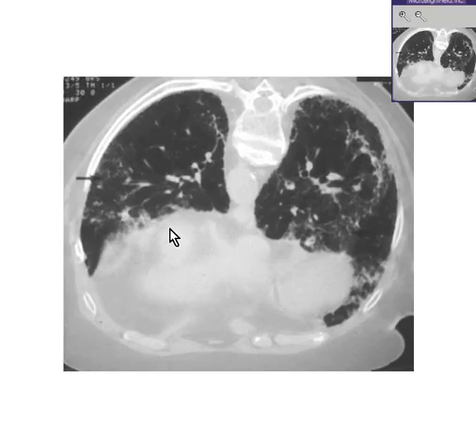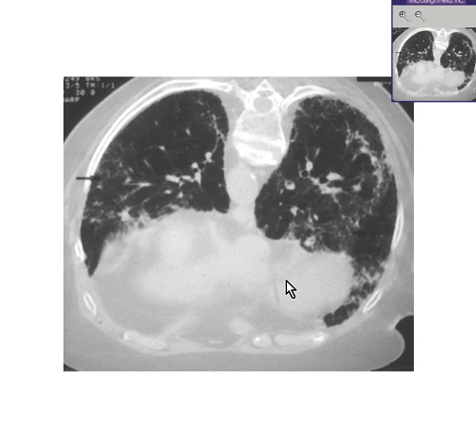Here is a CT of a lung. You could see the mediastinum, you could see the spine, and you could see the lungs.